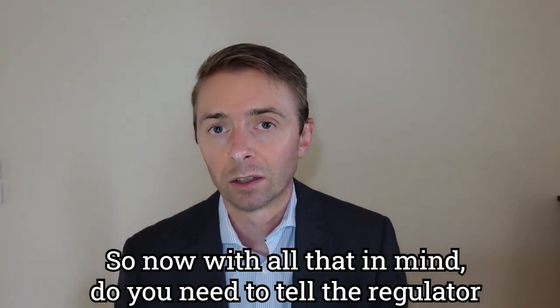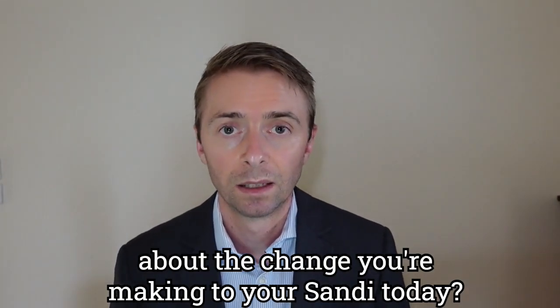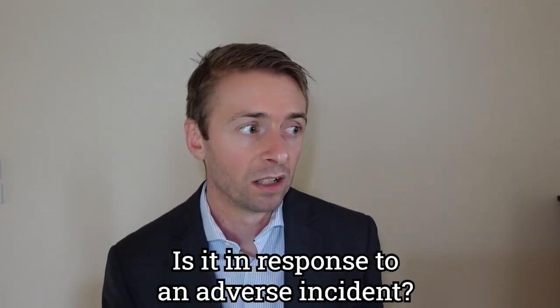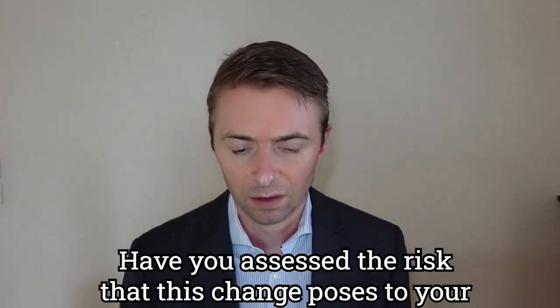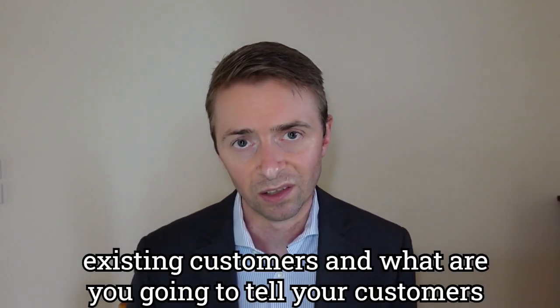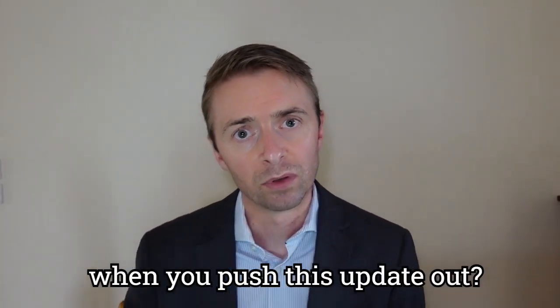So now, with all that in mind, do you need to tell the regulator about the change you're making to your SaMD today? Is it a reportable change? Is it in response to an adverse incident? Have you assessed the risk that this change poses to your existing customers? And what are you going to tell your customers when you push this update out?